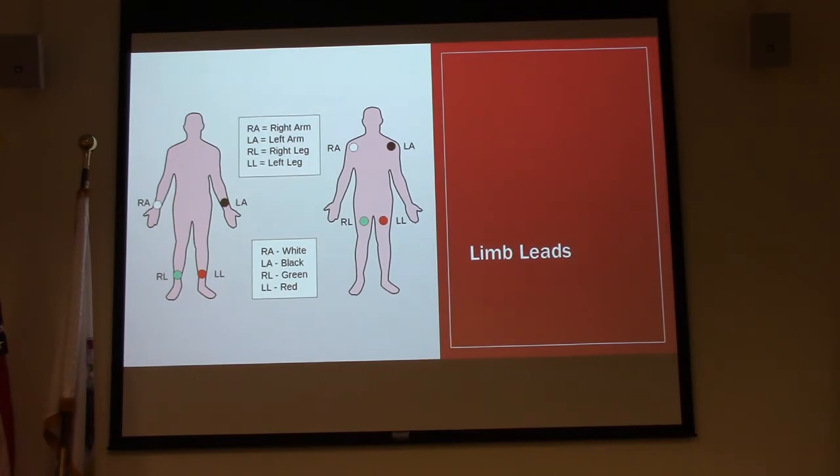If you are just monitoring on a 12 lead, fine, you can use the thoracic area. But if you are using your 12 lead to identify a possible STEMI, or in a diagnostic fashion, it has to be on the limbs. Why? Because the computer in your monitor is set up to measure certain radiuses and axes based on a program when you put these limb leads on.